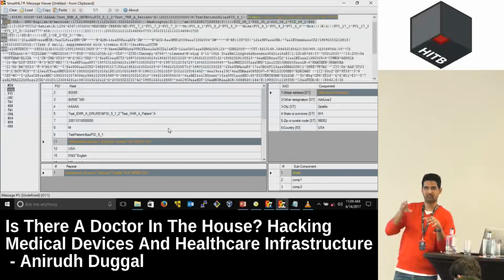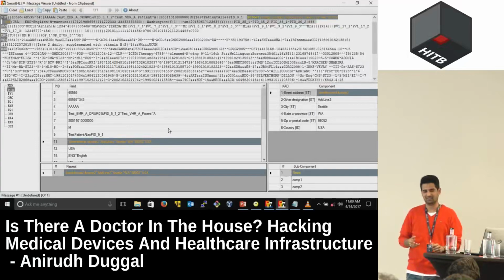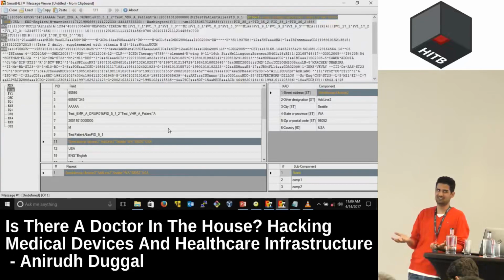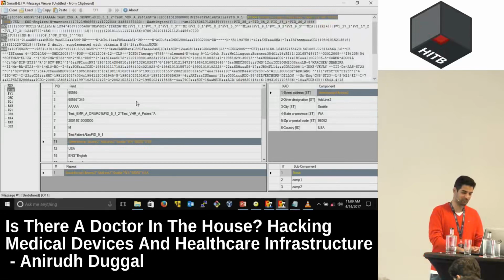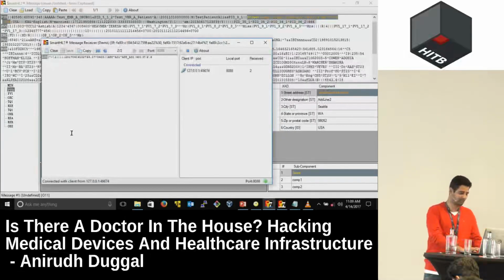If you change that file, you can actually fetch resources from Google. And I'm not joking. This is something that happened. I was talking to someone from the field, and they said that a doctor needs access to Facebook because he gets bored in the evenings, and so you have in the end an MRI machine which has access to Facebook, and this is a really common thing that happens because they don't really care about cybersecurity. So yes, you can actually create those kind of fields and do an LFI, local file inclusion, and you can fetch resources from the internet.